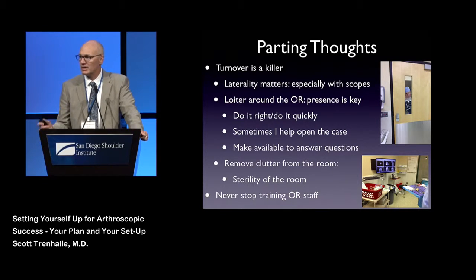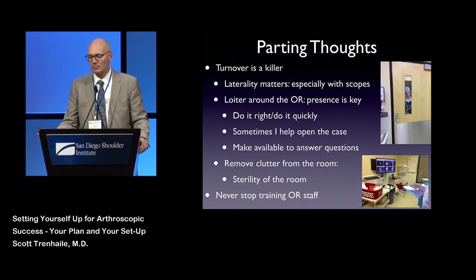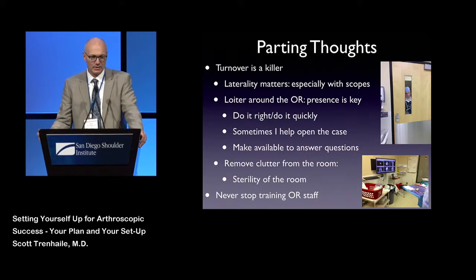And the other big thing is I try to really preach avoiding clutter in the room, because that can create sterility problems, people running into things, tearing down things, having to re-prep and drape things, which is very problematic on so many levels. And so I think orderly and tidy working spaces are a good thing.